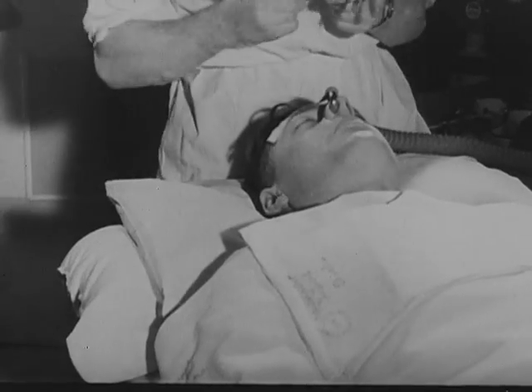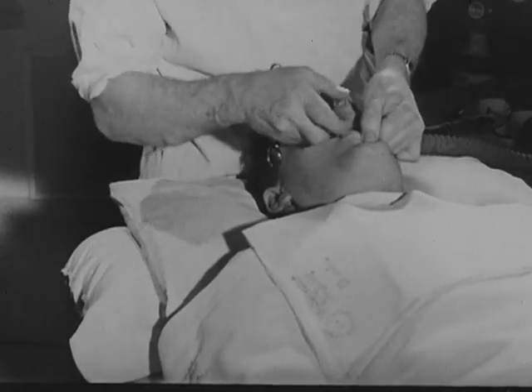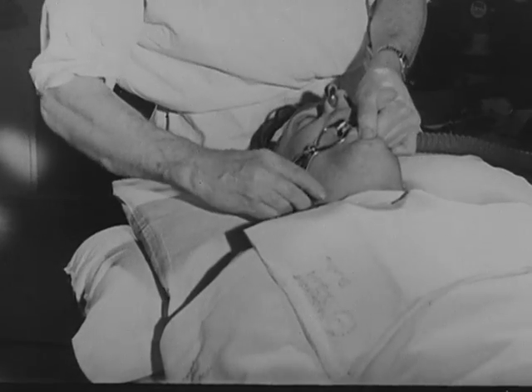The throat can be packed with gauze as in oral intubation in cases where there is any chance of blood reaching the larynx.